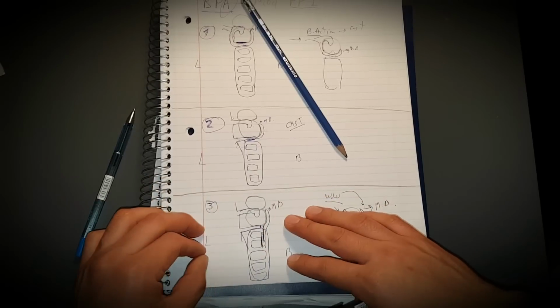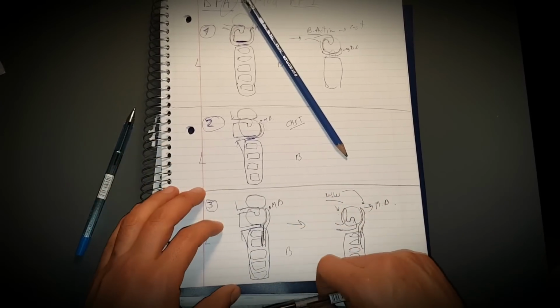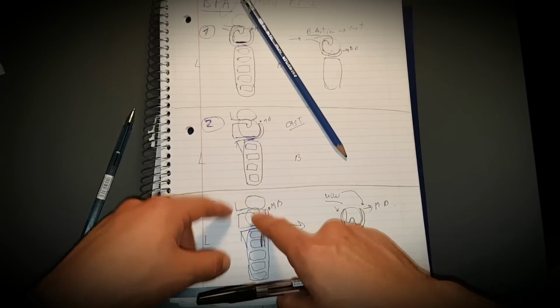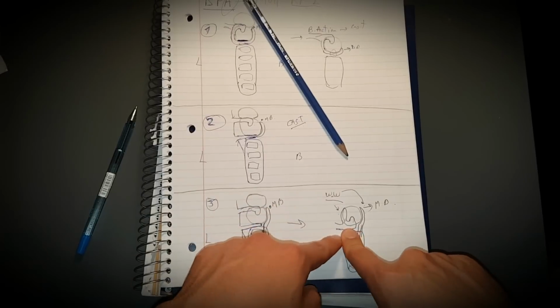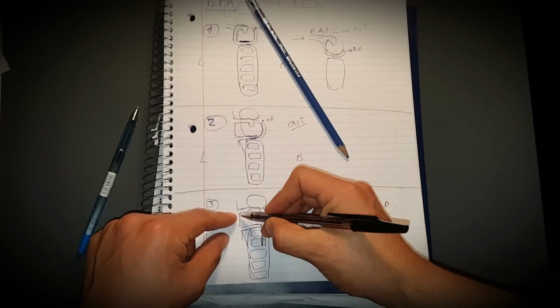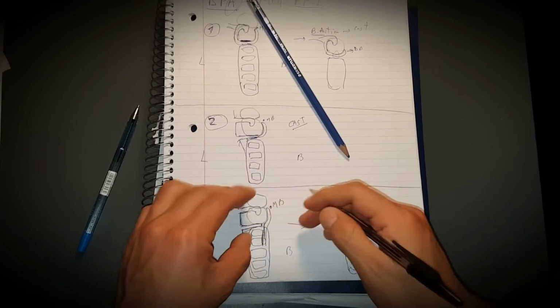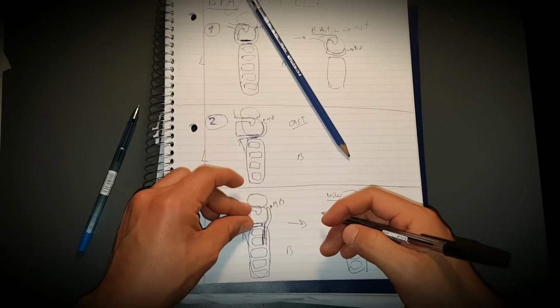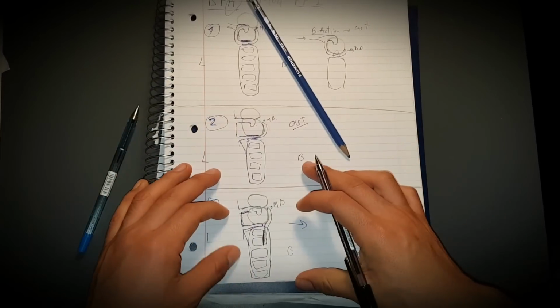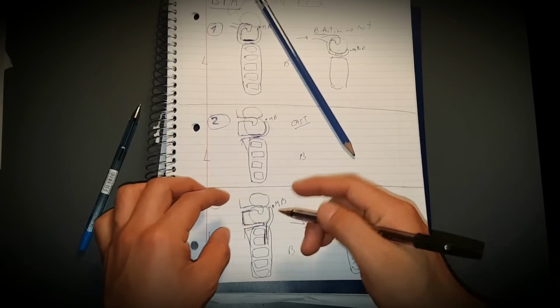Here we have the design of an RPA, which has a mesial rest and a distal guiding plane, but doesn't have a reciprocal arm as a combination clasp does. But the reciprocation is given by the minor connector and part of the structure here. This is the reciprocation area that functions as a kind of reciprocating arm. That's the way it functions.